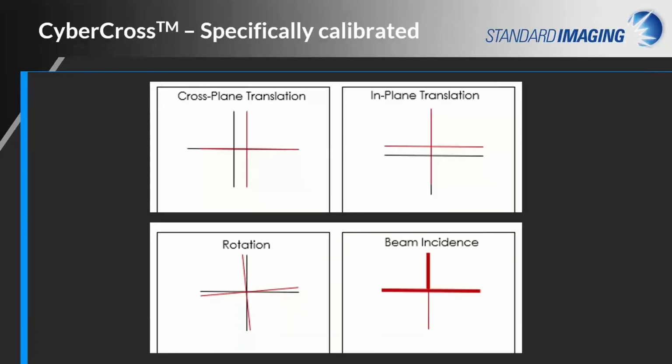The CyberCross uses a lens to create a laser crosshair. As such, the device requires a simple calibration procedure before first use. Note that this calibration will be machine-specific. Adjusting the lens affects the shape, line thickness, and location, centering of the crosshair.